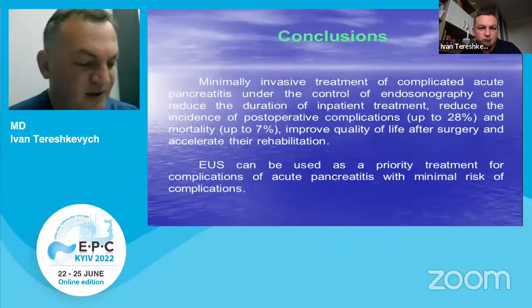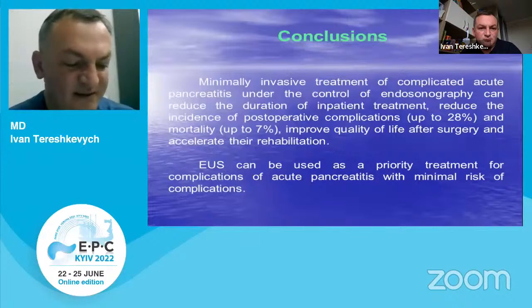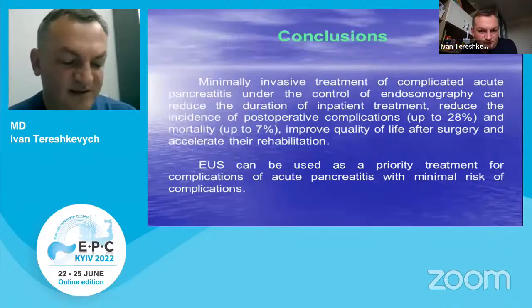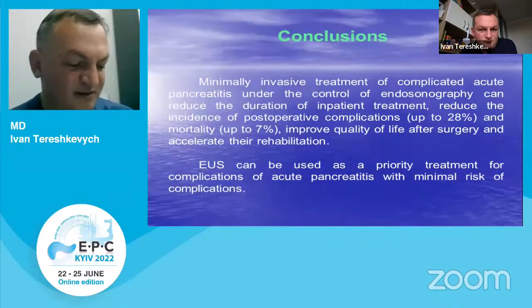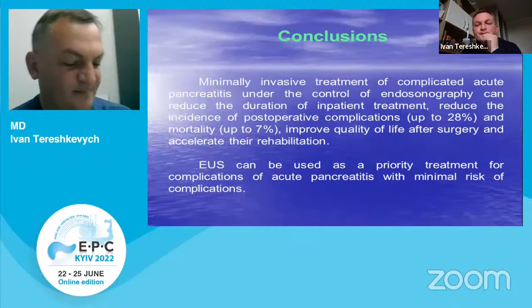Conclusions. Minimally invasive treatment of complicated acute pancreatitis under the control of endosonography can reduce the duration of inpatient treatment, reduce the incidence of postoperative complications and mortality, improve quality of life after surgery, and accelerate rehabilitation. EUS can be used as a priority treatment for complications of acute pancreatitis with minimal risk of complications.